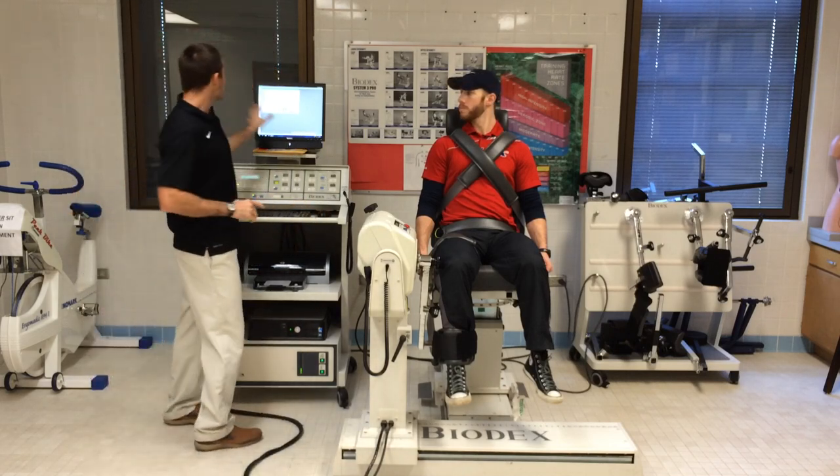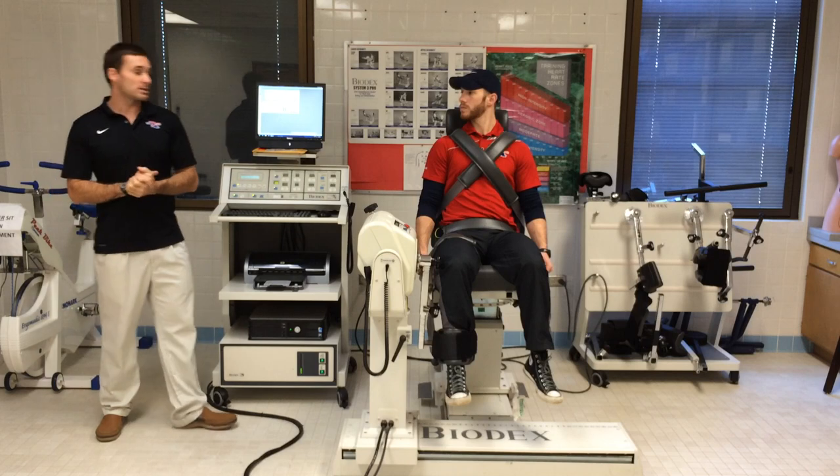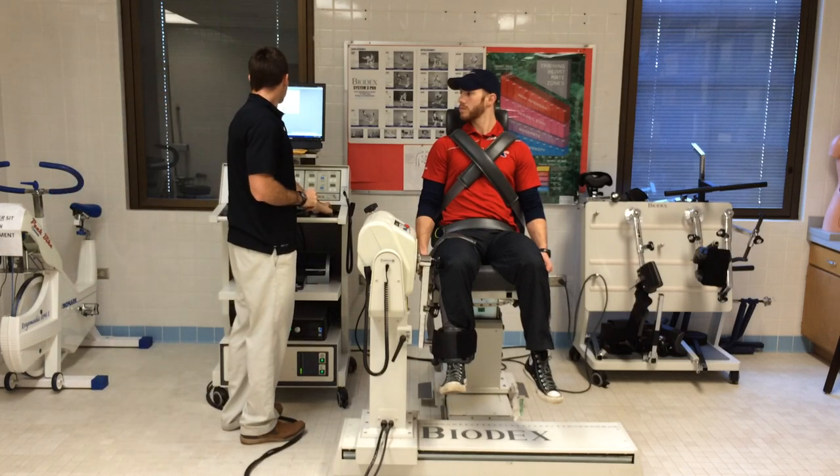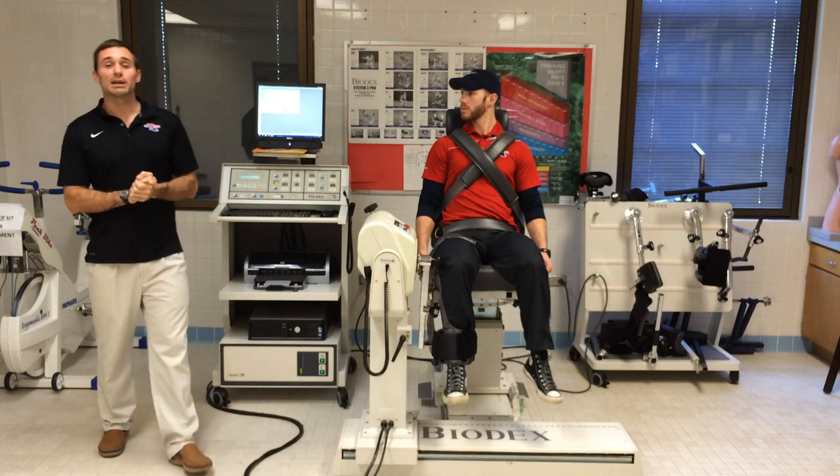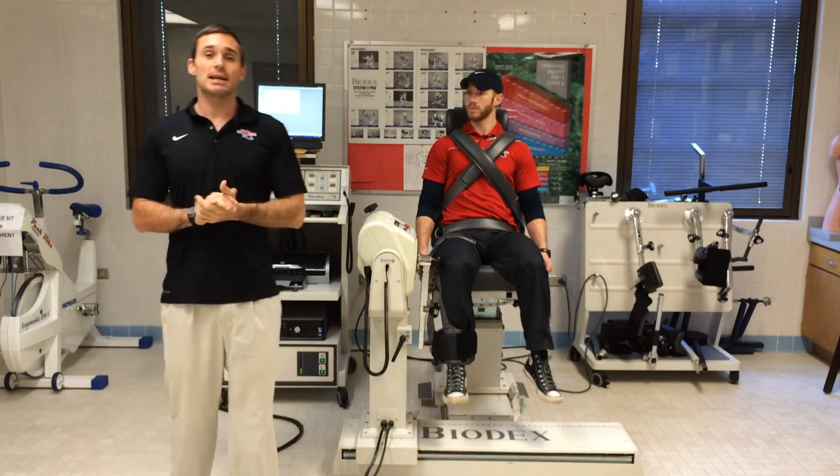At this point, we have completely set everything up. We are ready to do the test. There's a little green button right here that says go. Before we click it, we always want to make sure we explain the test to our subject.